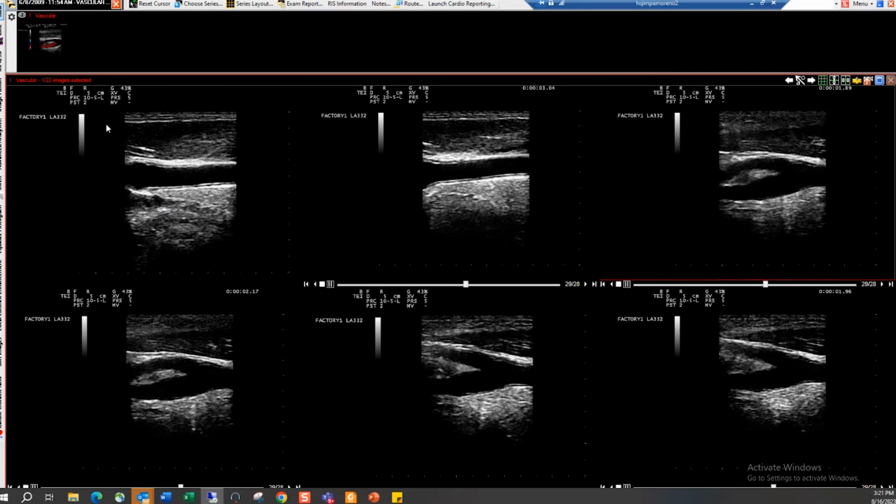In my practice, I couldn't look at an echocardiogram on the same machine as a cardiac cath. I couldn't look at the patient's chest X-ray without logging into another system or going to a different place. And so with NovaCardio, if I want to look at a cardiac study, that's great, but I still have the capacity to do, I have the full PACS. So if I want to look at the chest X-ray, I can look at the chest X-ray. I can look at the ECGs. It becomes a one-stop shop, which is really a nice thing to have.